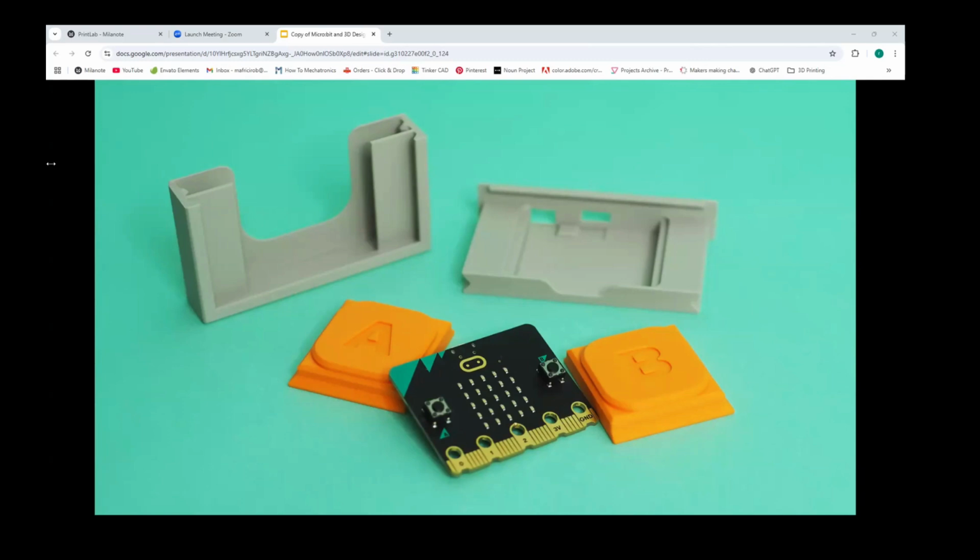Well, to keep the part count down, we decided to build that button into the case as a flexure button. And this again makes assembly easier and is just another example of how you can use a bit of clever design to make your user's assembly experience a little bit easier. And that's been at the forefront of the design of the tap all the way through. We just wanted it to be as easy to put together as possible.